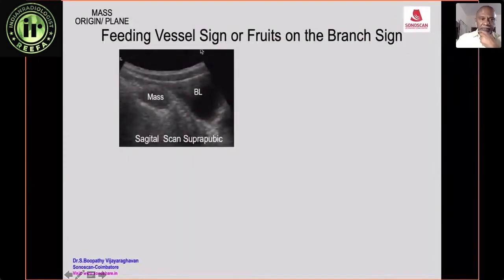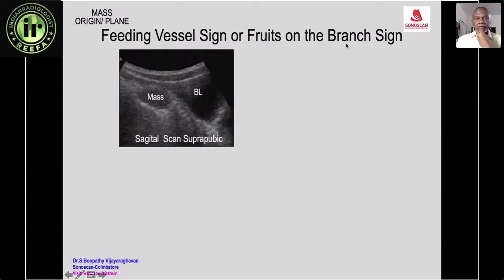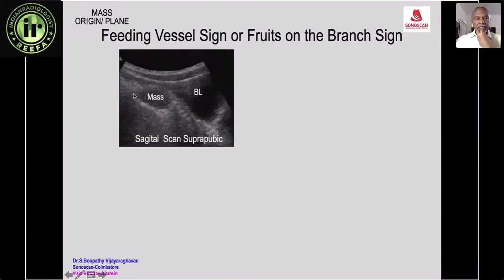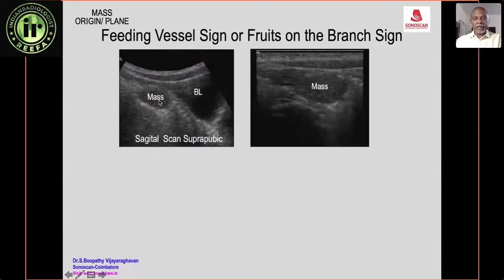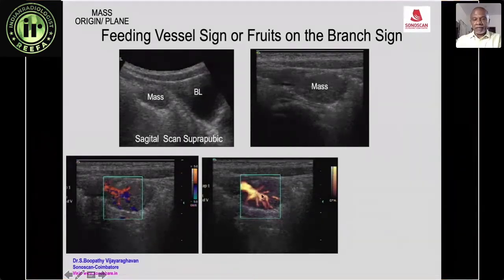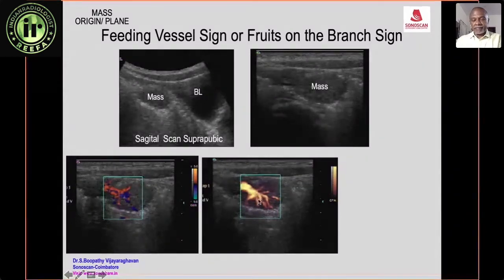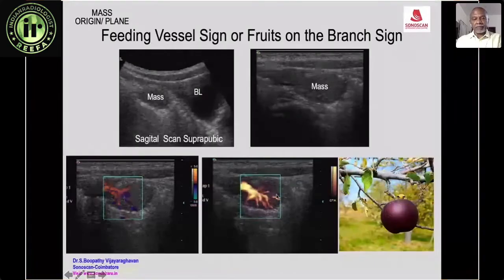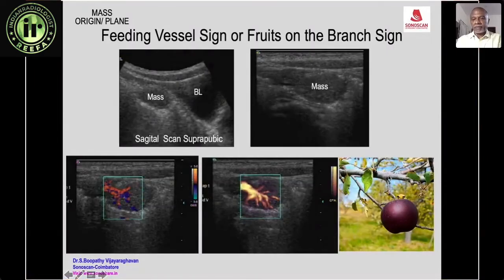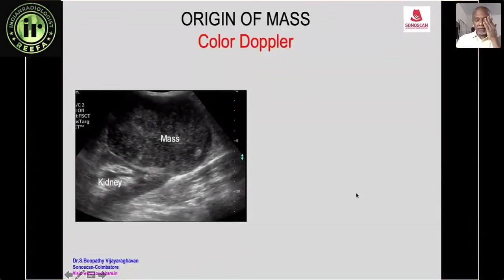The feeding vessel sign, also called the fruit-on-the-branch sign: a patient presenting with melena has a mass above the urinary bladder. On color Doppler, a single large vessel is seen supplying the mass and branching within it — the feeding vessel sign. This confirms it is a colonic polyp, where the feeding vessel is the stalk of the fruit.